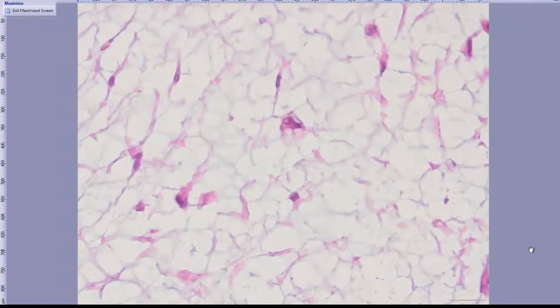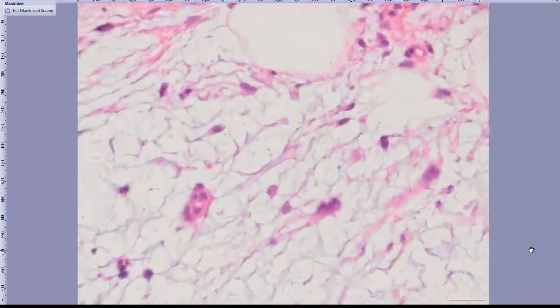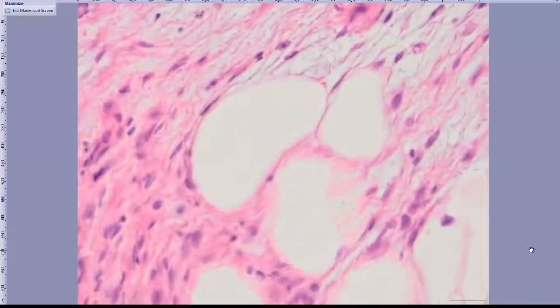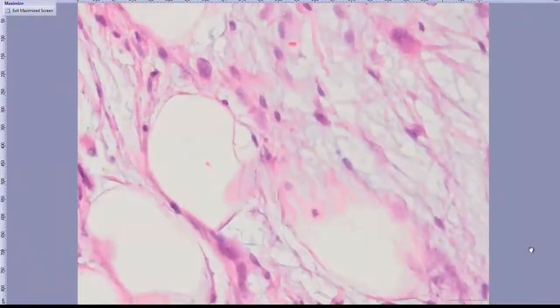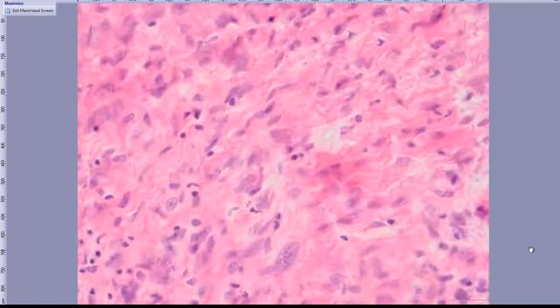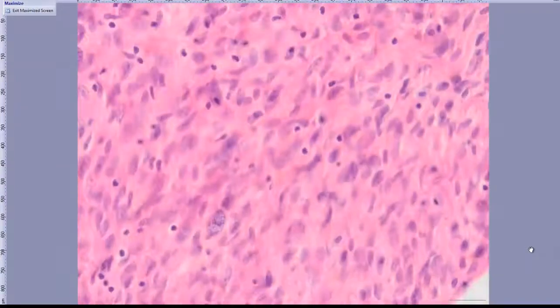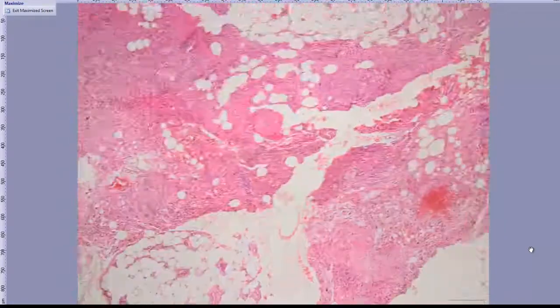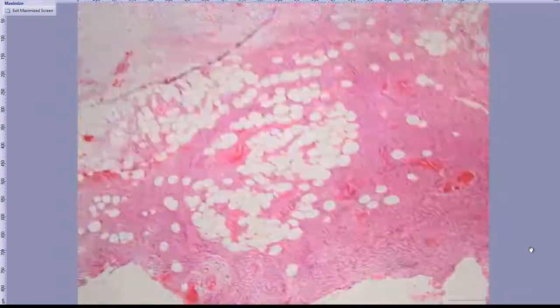are not compatible with the diagnosis of HFLT, I mean hemosiderotic fibrolipomatous tumor, and it is also not diagnostic for myxoinflammatory fibroblastic sarcoma. So this tumor, this is another slide, and this is almost the same.